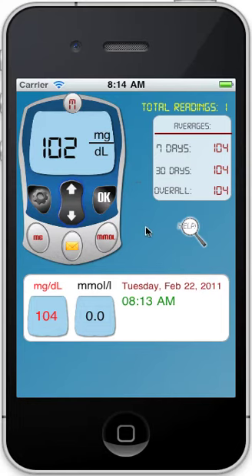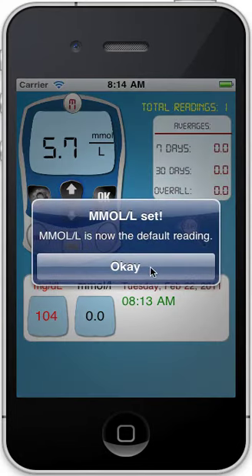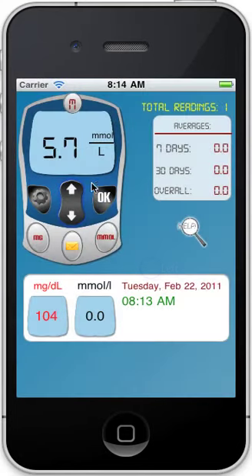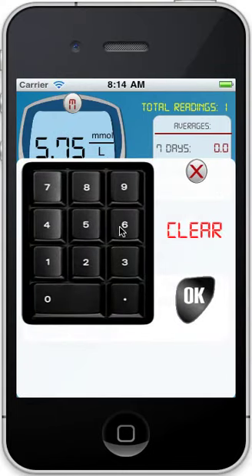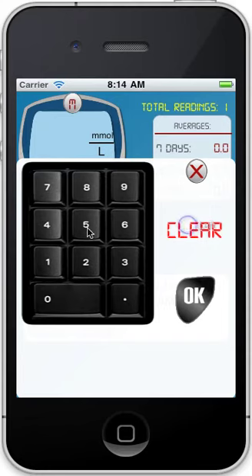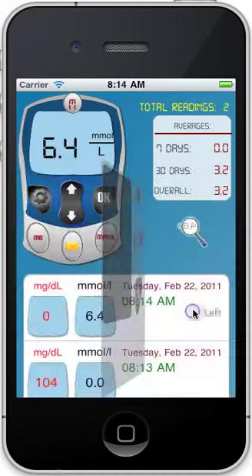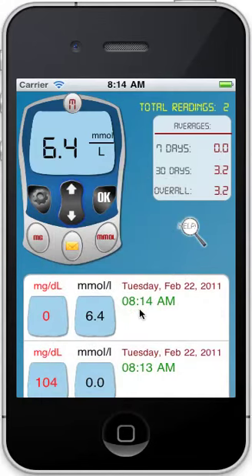Now if I want to do millimoles, I tap on millimoles. Now it's set for millimoles. I can tap on here and enter my millimole reading. Let's say 6.4 — I click OK. Now I'm in millimoles, and you'll see the millimoles reading right here.